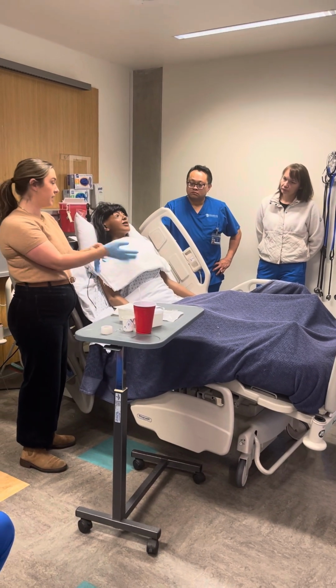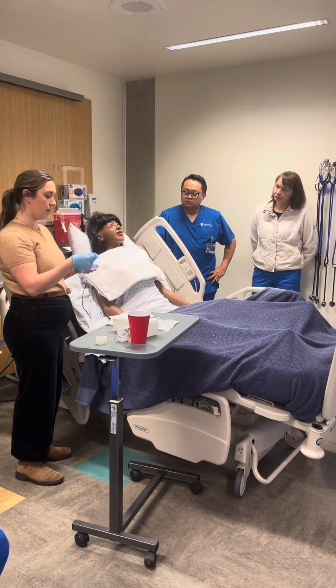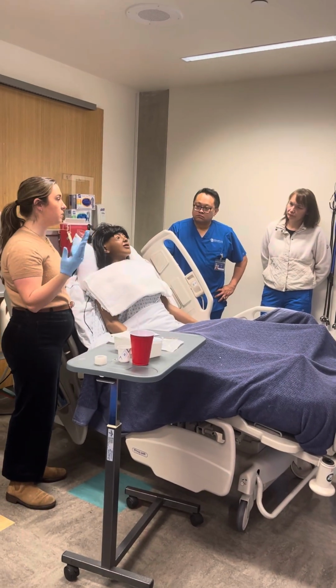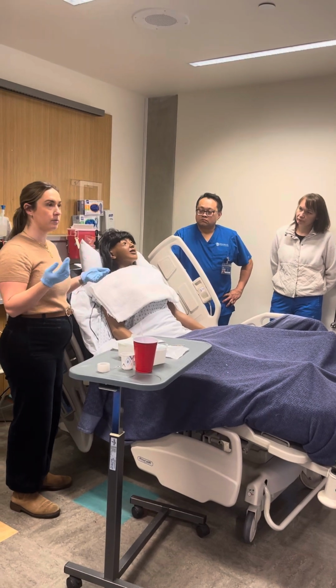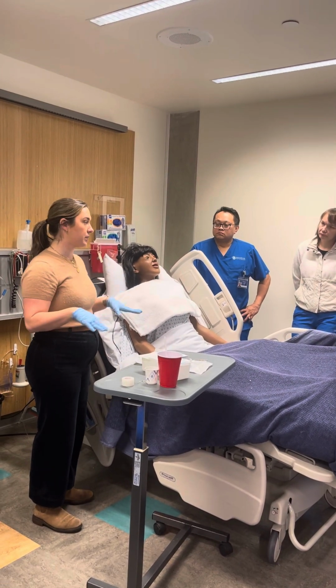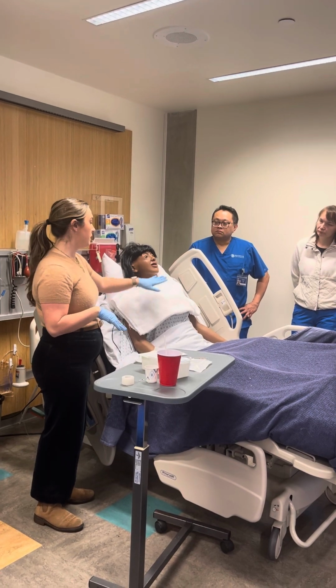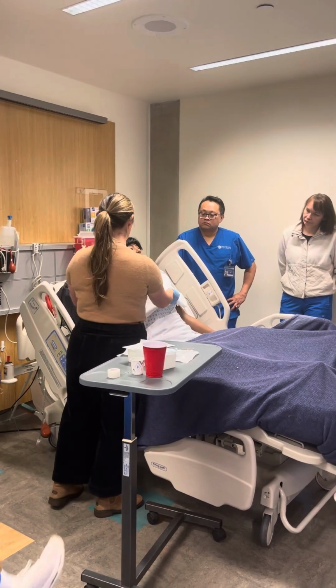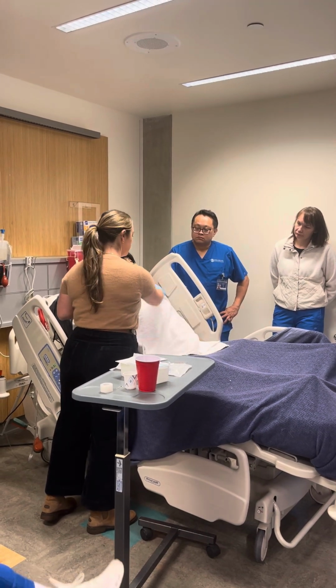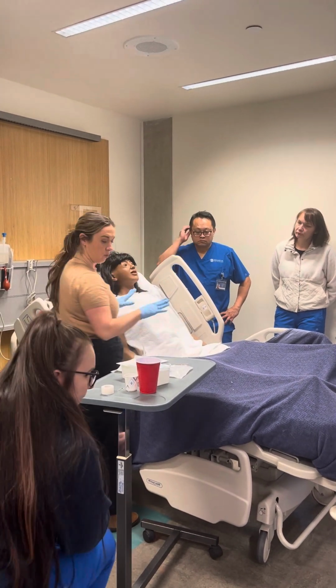I've done my hand hygiene, and I'm putting my gloves on. This is another thing where once you start doing this, your hands are going to be really slippery and covered in lube, so you want to prepare as much as possible ahead of time. So I have my towel here, and I'm going to do it like this, because I'm going to use this space a little bit for my tube.